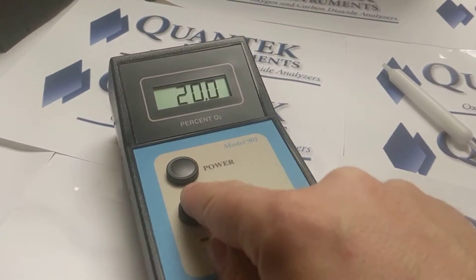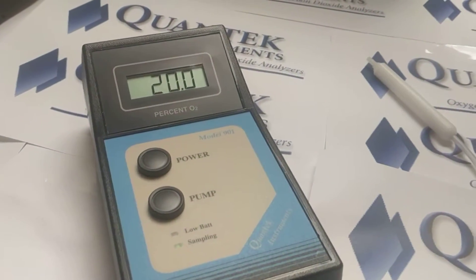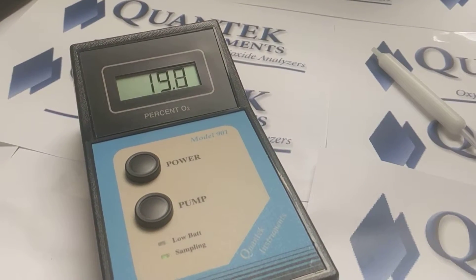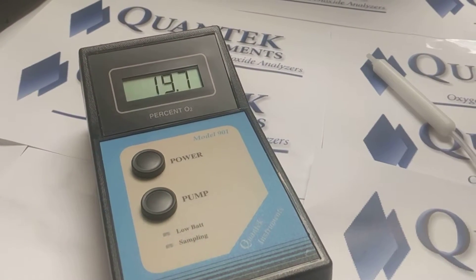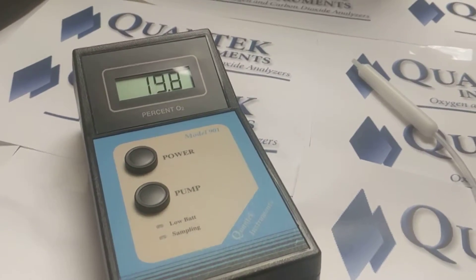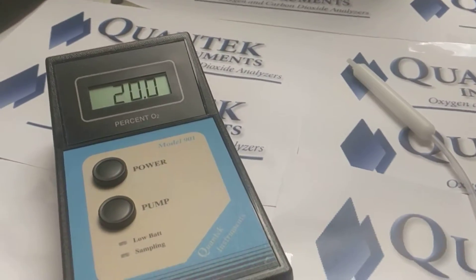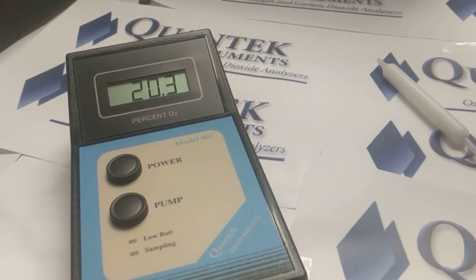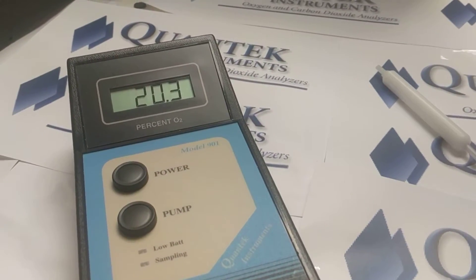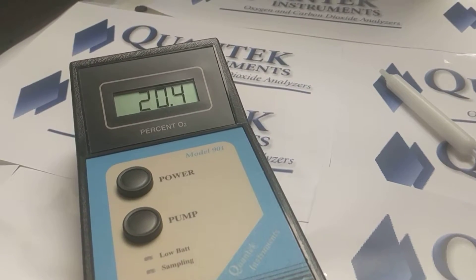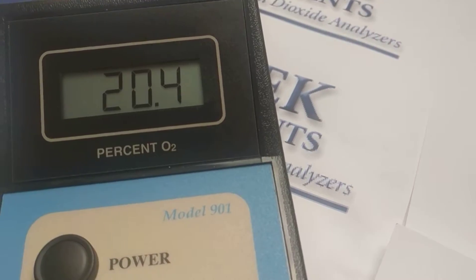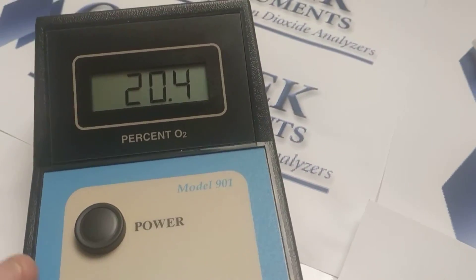So the first thing we're going to do is press the pump button and make sure before we do any adjustments, we're going to make sure that there is a fresh sample in the instrument. Now this instrument was just handed to me. I have no idea if it's actually been calibrated, but no worries. We'll be able to calibrate it here and demonstrate it for you. So as you can see, the reading is stabilized at 20.4, so this needs to be adjusted.